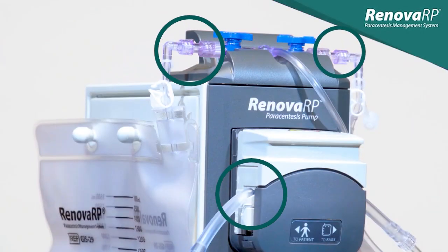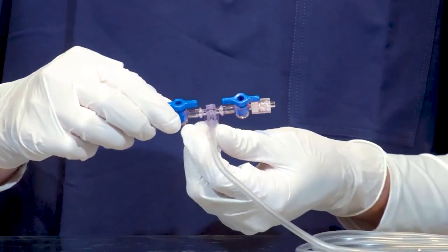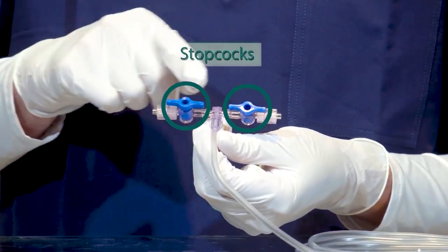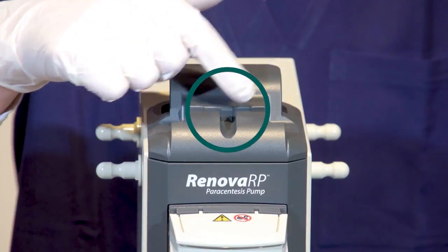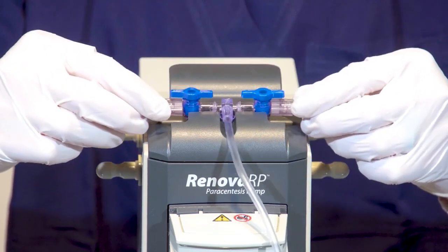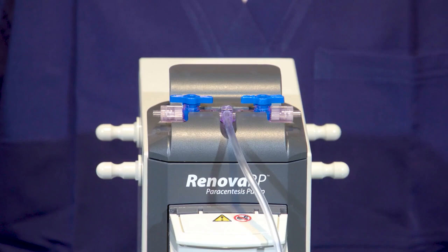Proper loading of the Renova RP Tubeset and connection of the Renova RP Drainage Bags are two of the most vital parts of the system operation. One end of the Renova RP Tubeset features a pair of stopcocks and is in the shape of a T. This T-connector fits into the recessed area at the top of the pump. Press down firmly at the center of the T-connector to ensure it is properly seated.